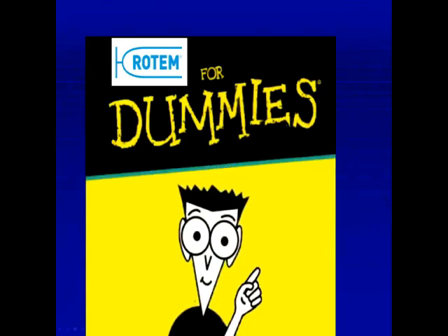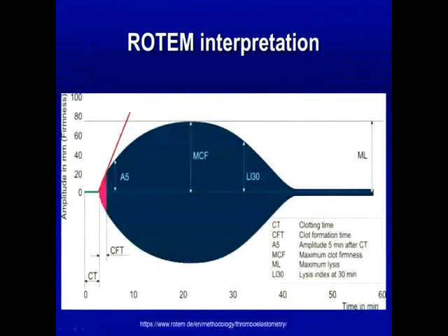So we'll go through how to interpret the Rotem data and the curves. It can be complicated, but generally it's very quick to pick up because there's only a few values that you really need to know in order to use it. So this is a typical Rotem curve. The x-axis is time in minutes, and so that's what you're looking at for when the clot starts to form. The y-axis is amplitude, and the amplitude is supposed to reflect the strength of the clot.